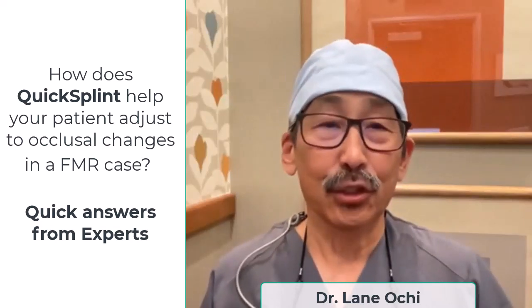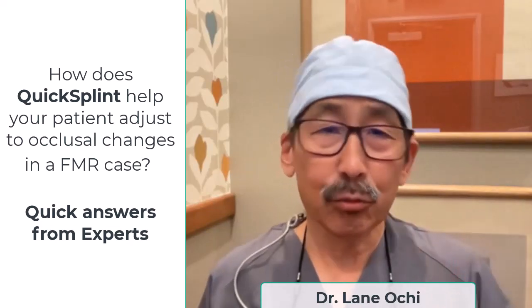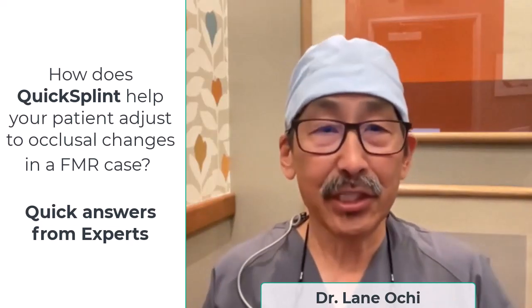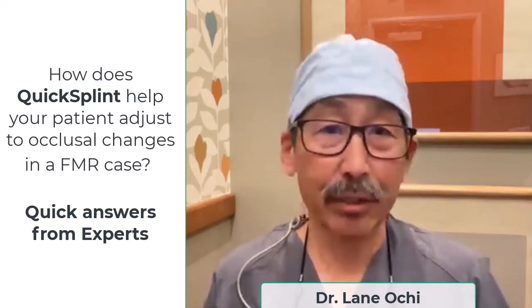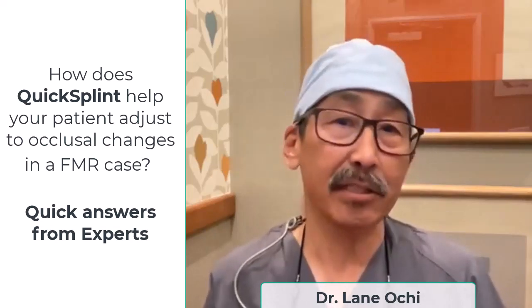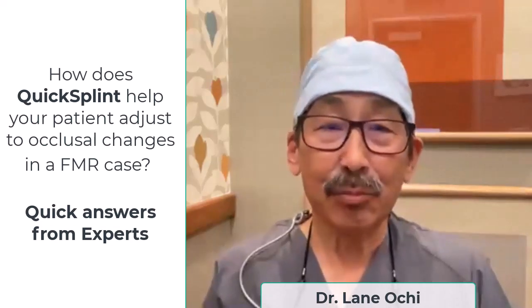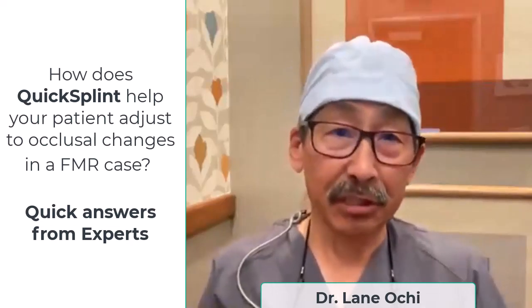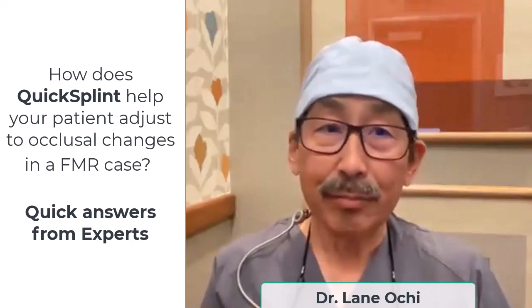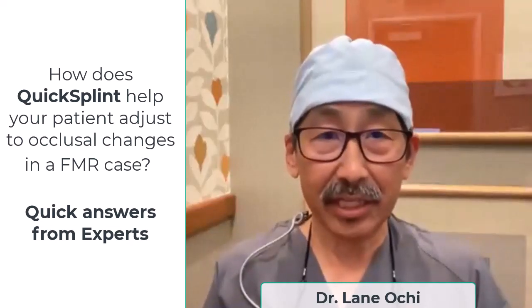The quick splint is one of the most important tools when doing a full mouth reconstruction. We like to use it when the patient is in the provisional phase. That way, we don't have to worry about provisionals breaking or popping off, especially if the anteriors are veneers. It allows more muscle settling and relaxation, so when it comes time to deliver the final case, we can be assured that the patient is in an orthopedically stable and comfortable position.